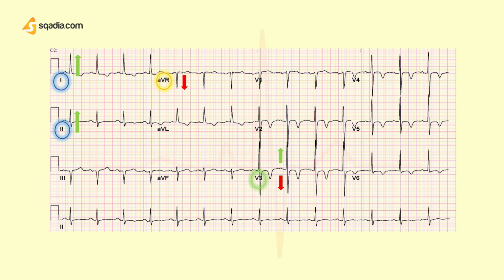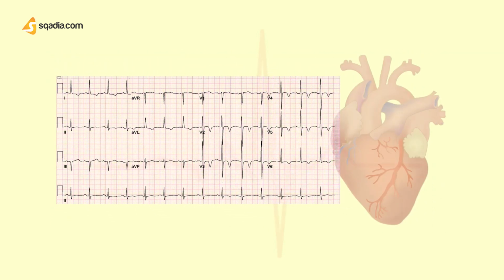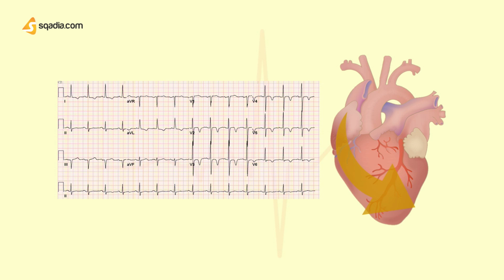Now, as we just mentioned, we have the normal electrical movement, which moves in this general direction. However, all are going in different directions when looking at it from a different point of view, which is where we place the chest leads. Now, some go this way and some go that way, but each activity is from a different vantage point. Therefore, an ECG is a different shape.